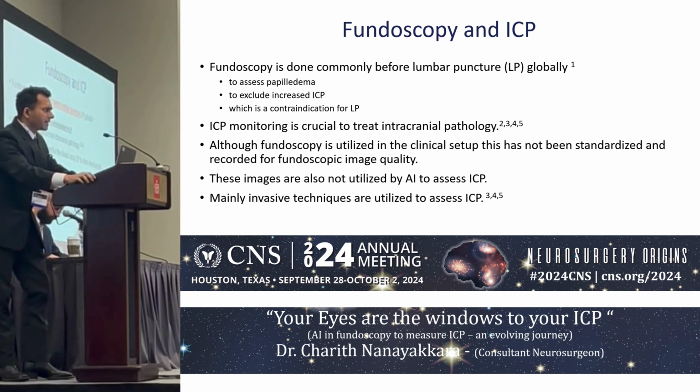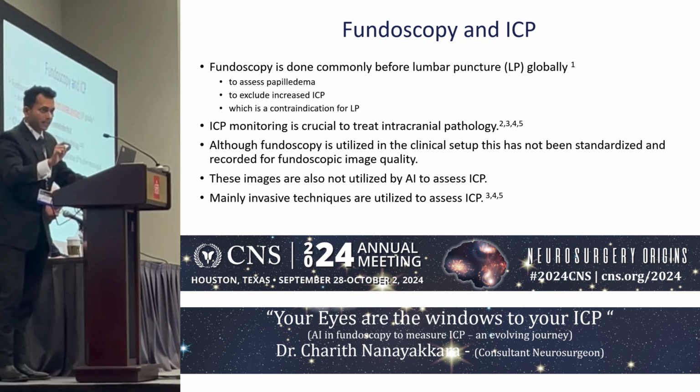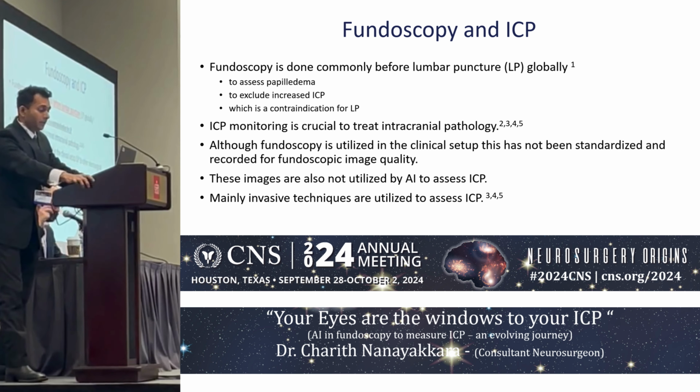So fundoscopy and ICP. Fundoscopy is done commonly before lumbar puncture. I'm sure you're aware of that. It is done globally to assess papilledema and to exclude increased ICP, which is the contraindication for lumbar puncture. ICP monitoring is crucial to treat intracranial pathology. Fundoscopy is utilized in the clinical setup, for instance lumbar puncture, and in other neurosurgical conditions.